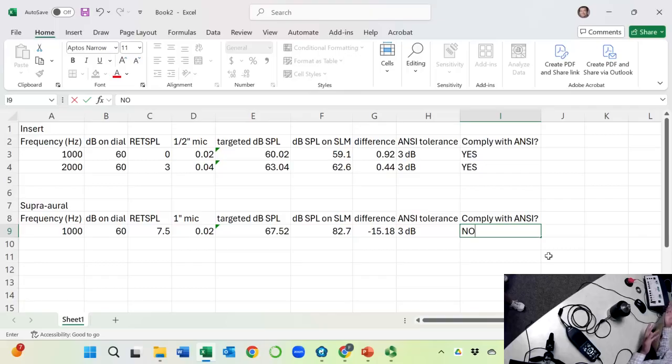I'm not using it for anything except for the demo. But the fact is, being off calibration is probably better for demo purposes. Does that make sense? It's not that it's broken. It's just off calibration. You can adjust it, and it's all good. That's how the companies come and do the adjustments every year. So it's off, but if you adjust it, it will come back as perfect. Okay, and that's for the supraoral headphone. Good. So let's move on to another transducer, the bone vibrator.